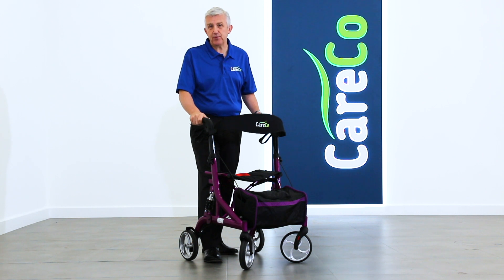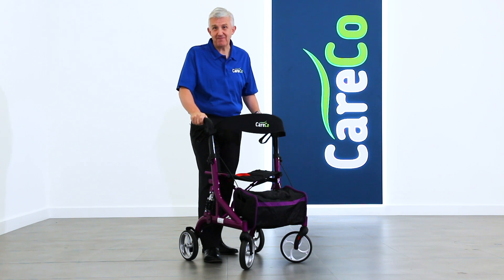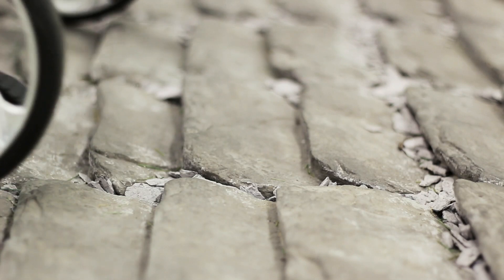This is the ultra-modern and impressive EVO suspension rollator, one of the most comfortable walking aids on the market. The EVO comes with a sophisticated suspension system built right into the frame itself, designed to dampen the resistance of rough and uneven terrain.